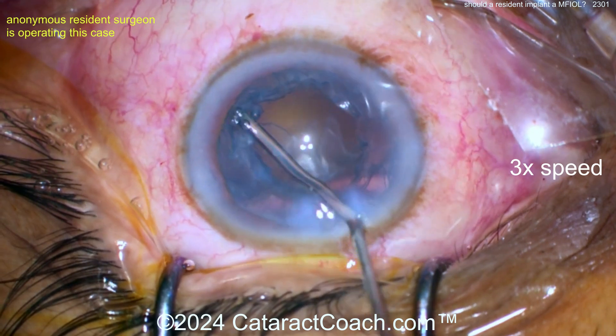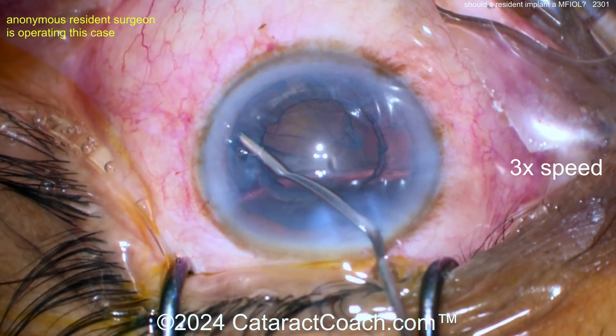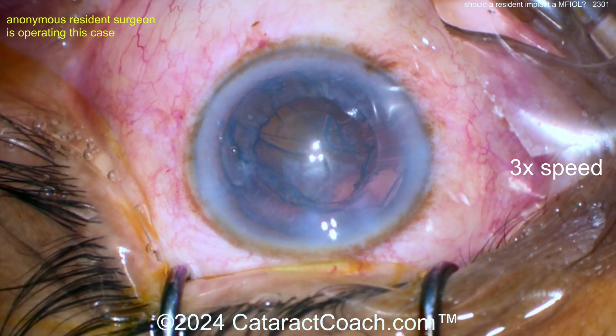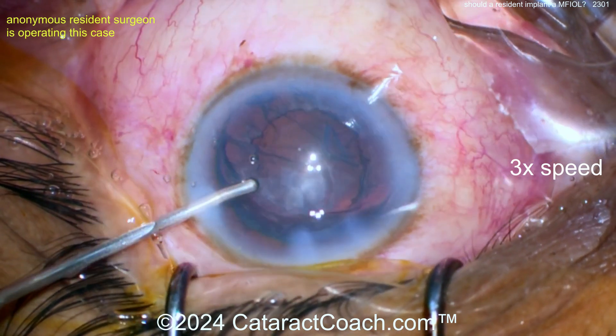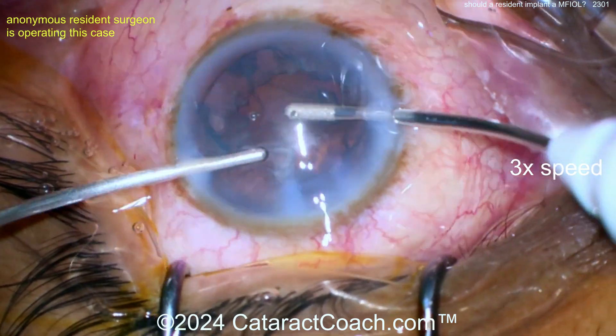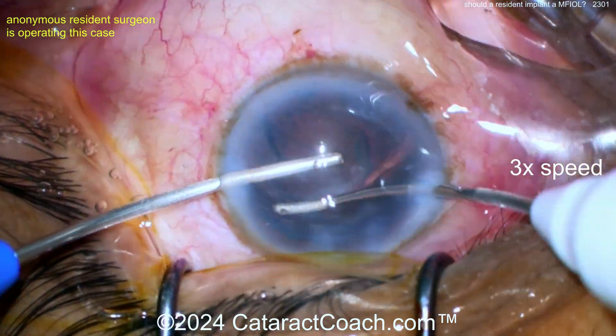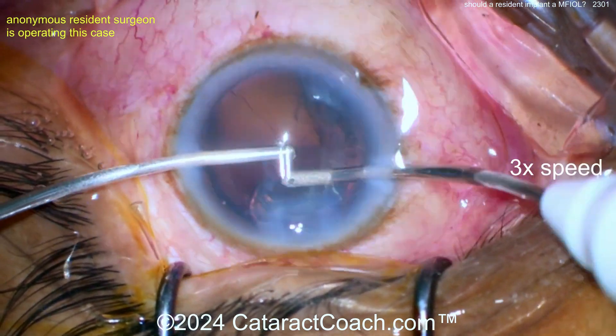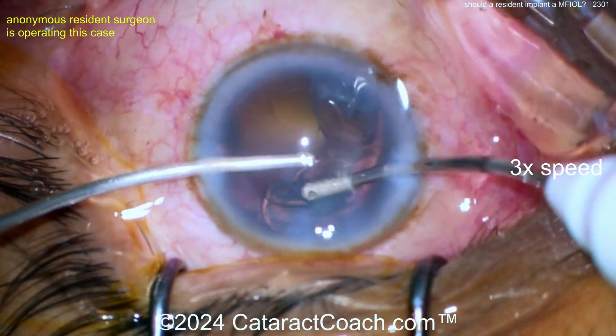Now let's look at the incision — it's kind of long. When you're sitting superiorly, remember the superior limbus is closer to the visual axis than the temporal limbus. The advantage of the temporal incision is it's farthest from the visual axis. So this superior incision, because it has a longer tunnel length, is encroaching not too far away from the visual axis. Here's the bimanual cortical cleanup with the irrigating probe.